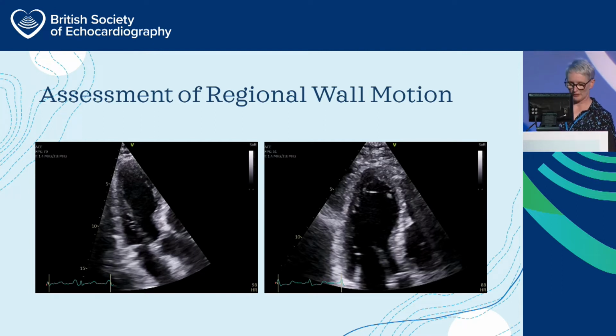We've seen it sort of in the parasternal long axis anyway. It's just suffice to say that once we get down to the apex, those segments don't work either. So it's likely then that the patient's had an extensive LAD infarct and perhaps some RCA involvement as well. But circumflex territory, I think you'll agree, looked fine throughout.